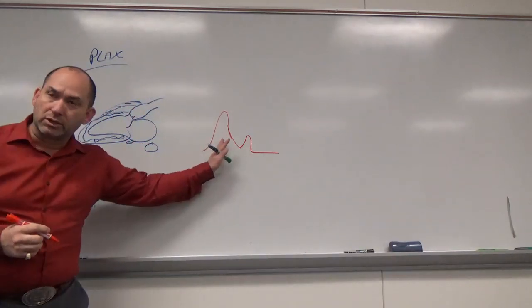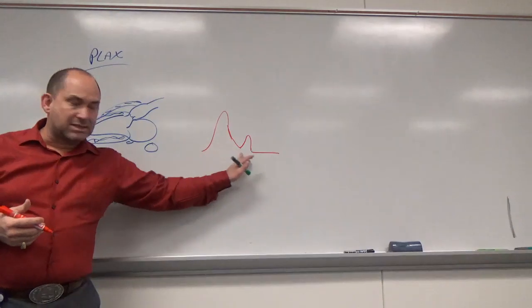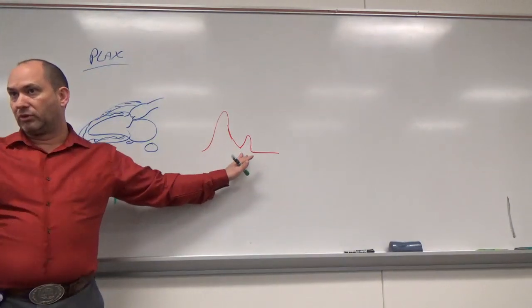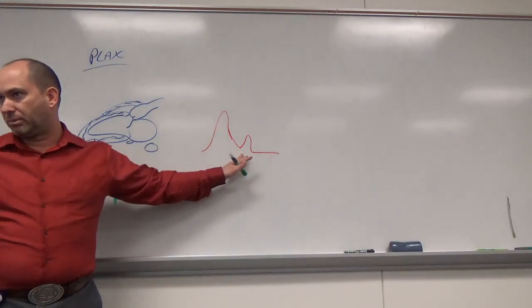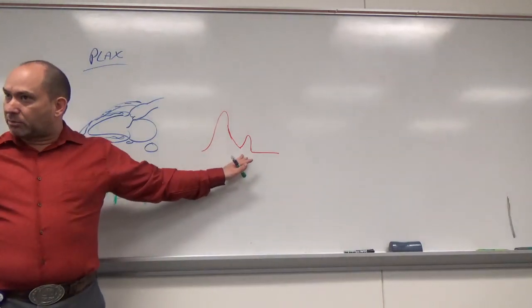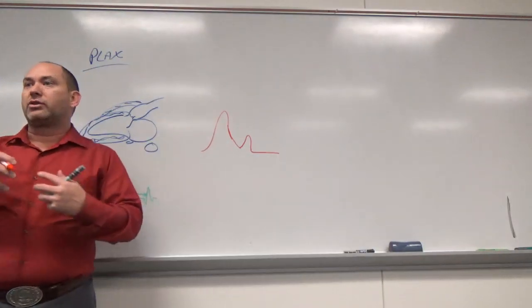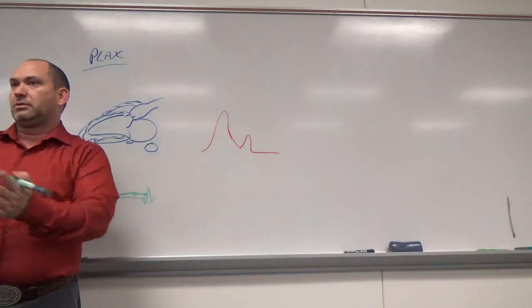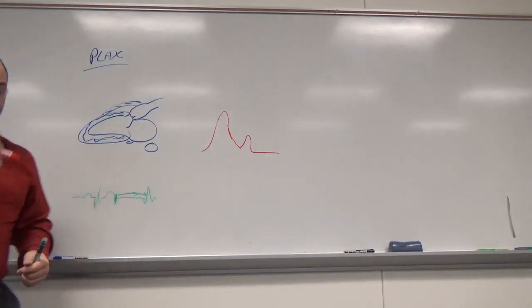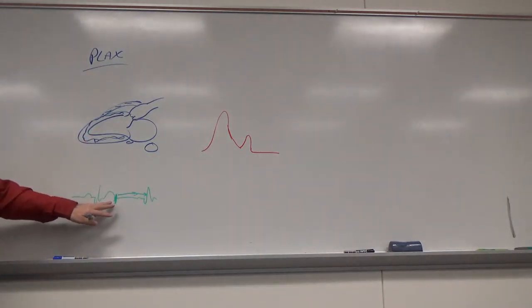Okay, so I've got an early ejection that gets a lot of blood. We got diastasis in the middle here that gives sort of the residual gradient that's just kind of residually passing through. And the backed up pressure from the lungs is continuing to push through. And then atrial contraction gives the last little bit, and then the ventricle squeezes and it shuts. Okay, that's our diastole.